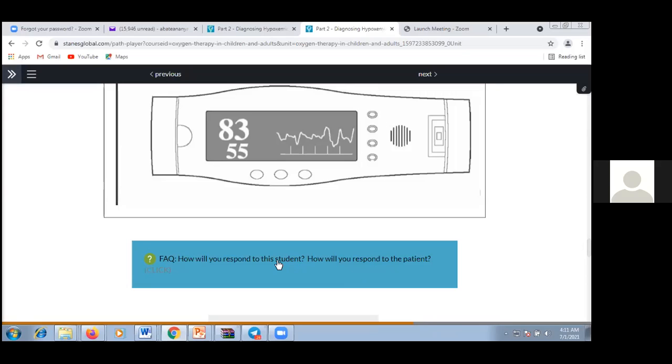Thank you, Dr. Mahalet. Yeah, this is one of the commonest things we are seeing. People put the pulse ox on the finger, see the reading, and focusing only on the reading, they may say, oh, the patient is hypoxemic, but the reality is the pulse ox may not be accurately detecting the reading. Because of that, you can know whenever you have a bad waveform. So for accurate measurement, there needs to be a good waveform associated with pulse ox application.